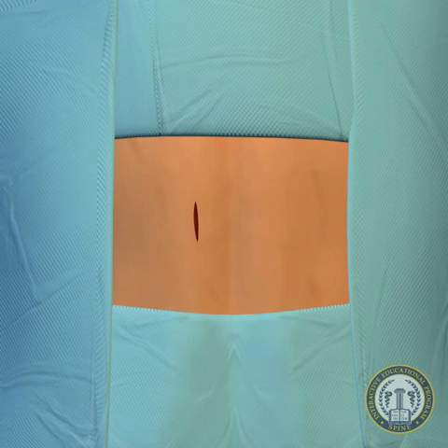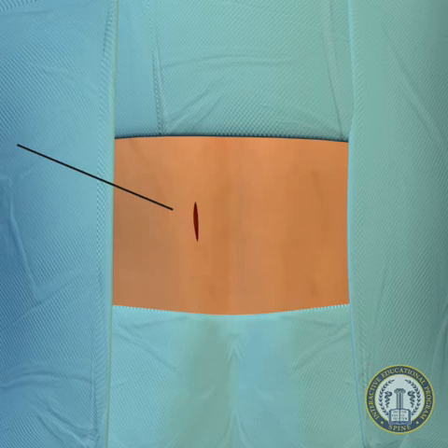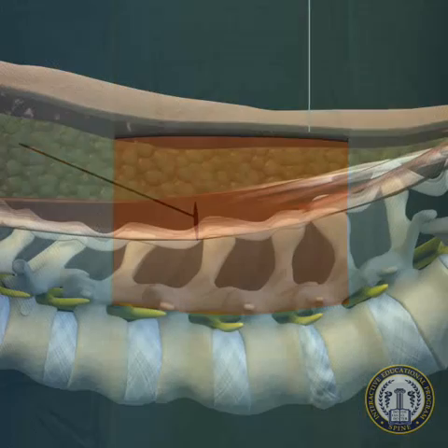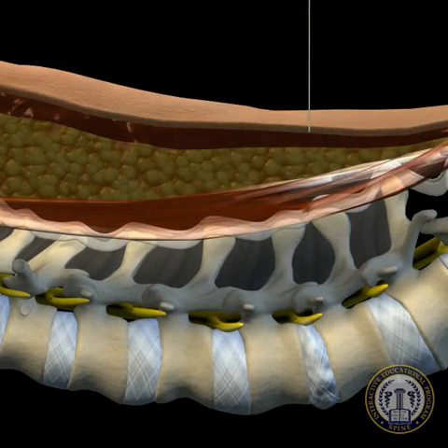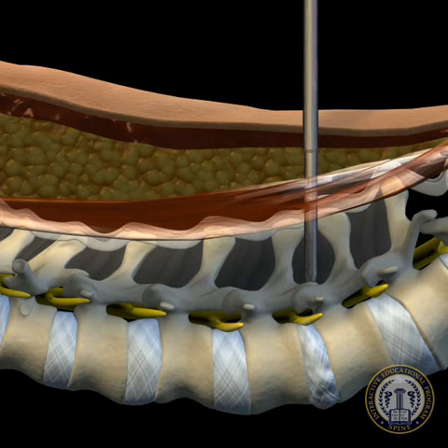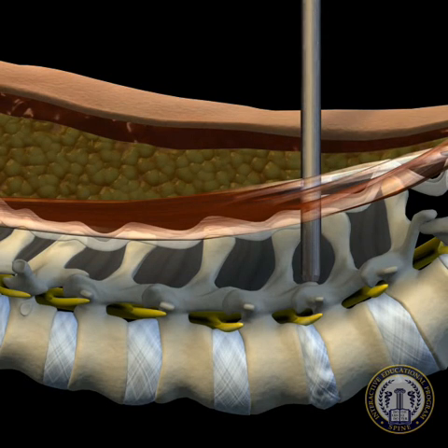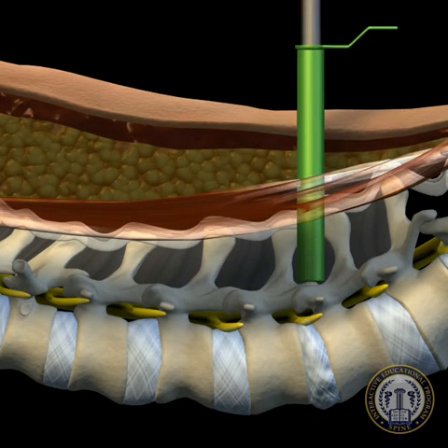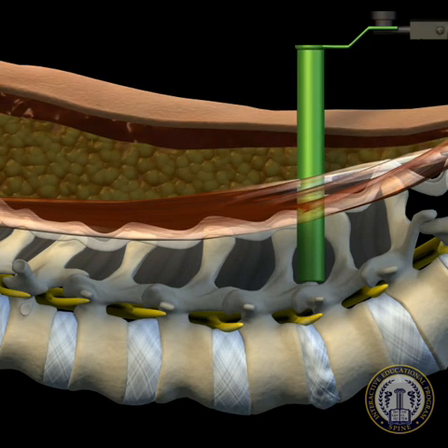A K-wire is directed using fluoroscopic guidance toward the facet complex with a lateral to medial trajectory. To minimize risk of neural injury, the wire is passed only through the fascia and muscle. Surgical dilators are then passed over the wire to develop a muscle-splitting surgical channel. A properly sized tubular retractor is then passed over the dilators and attached to the table frame via a flexible articulated frame.